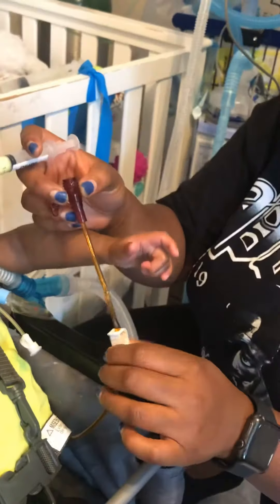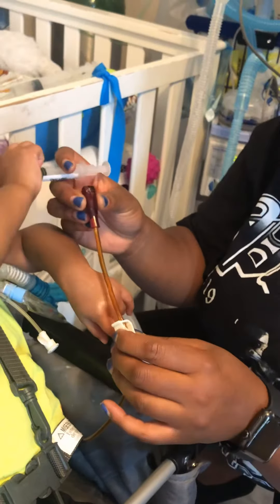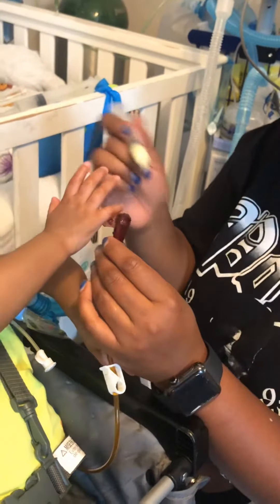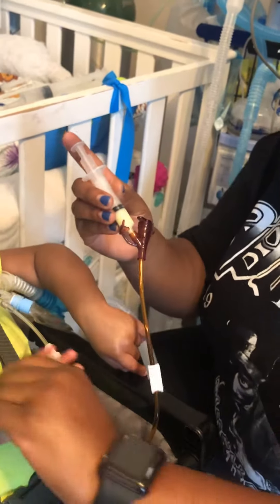You're going to clasp it before you take the syringe out, to make sure the medicine does not come out. And then you can put another medication in the small port.